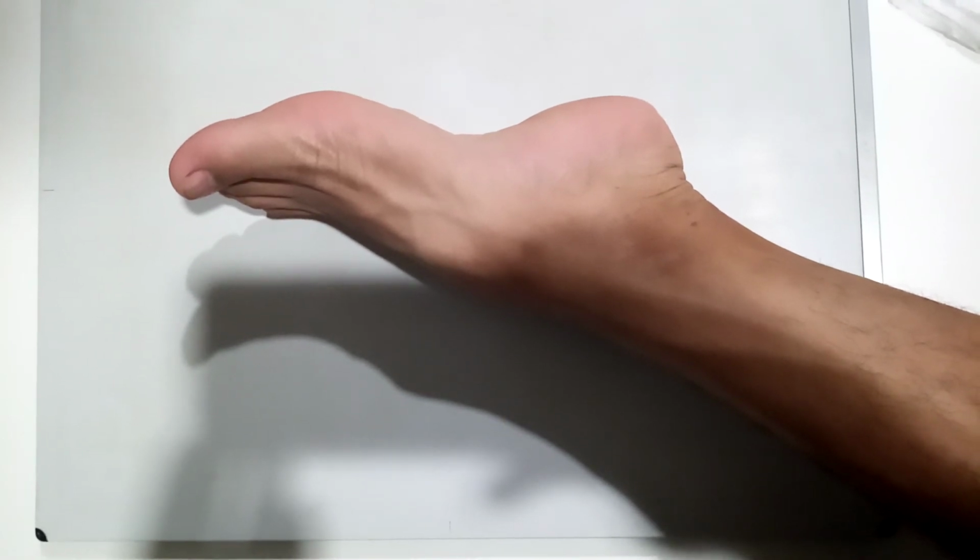The central ray must be perpendicular and centered to the area of the base of the third metatarsal.